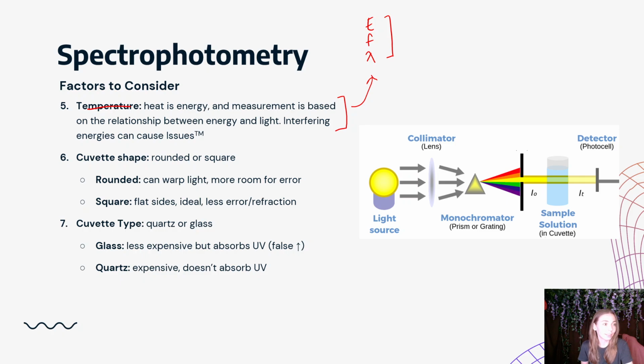There is a reason why laboratories have to be kept cold, and it's because the analyzers are instruments, and computers get hot when you use them. So you will have refrigeration systems that go crazy within these analyzers, just specifically trying to keep, at the very least, the reaction chamber at a realistic normal temperature to prevent the interference of heat from getting in the way and messing with our closed system up here.